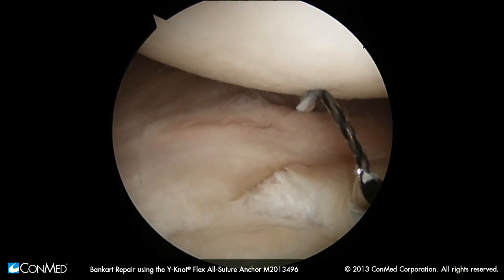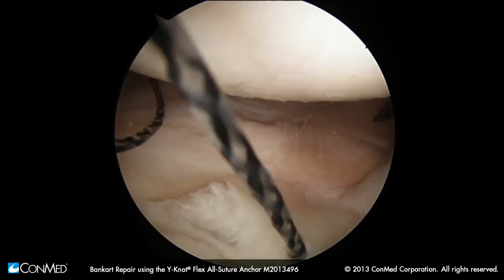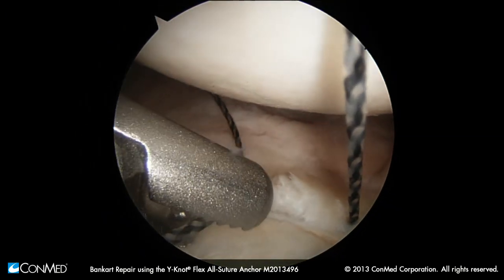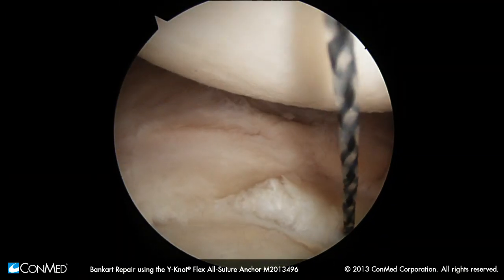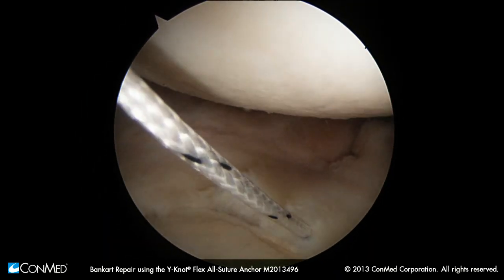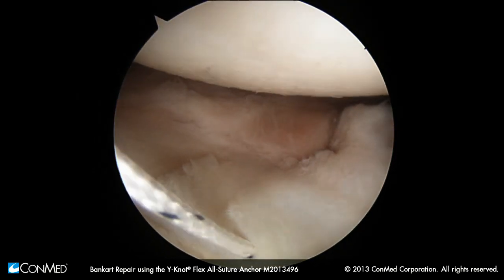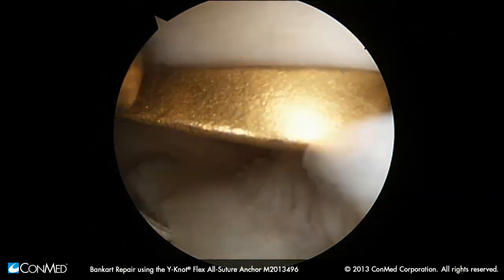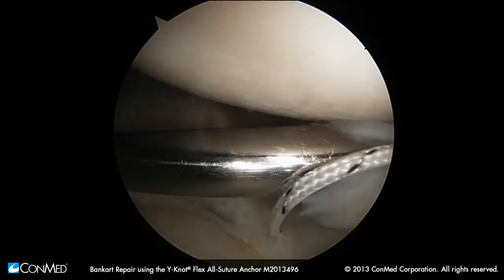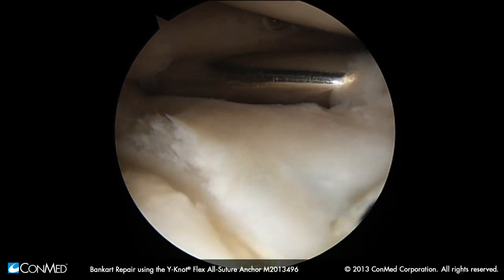You can see that we're just above our tear. We'll pass a simple stitch through there. This is our standard shuttling technique — we'd come in through the front and grab the end of our shuttle. That's a simple stitch, which is fine. You can use a mattress or you can use a figure of eight. We won't tie this right now because I don't want to do anything that's going to tighten up the shoulder and compromise my access anterior or inferior.